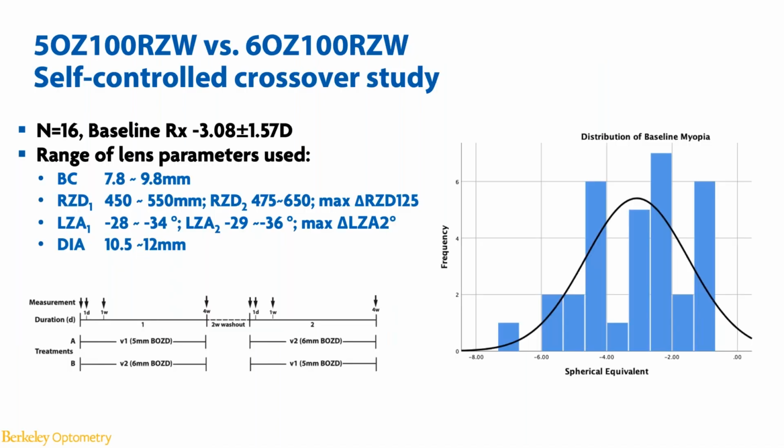So with that understanding, we have decided to use the design of a 5mm OZ combined with a 1mm return zone width. Again, that means the extra 1mm has 0.5mm extra in each side, all contributing to the landing zone. So we want to use this design to compare the original 6mm OZ design.